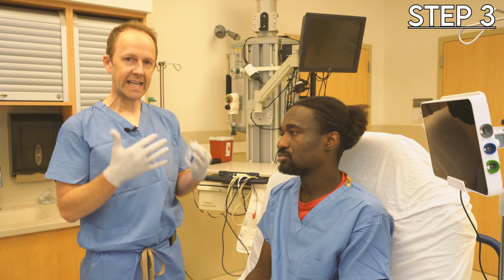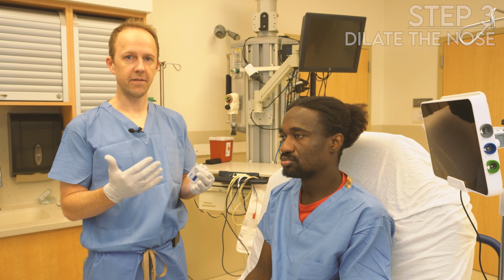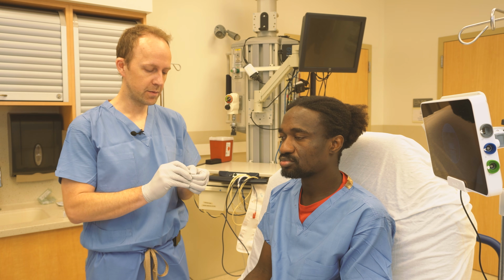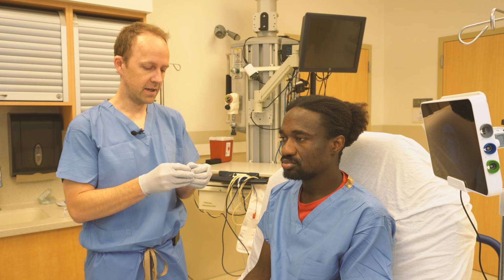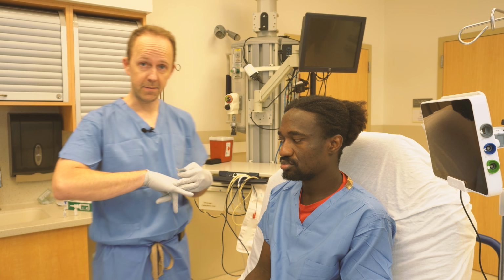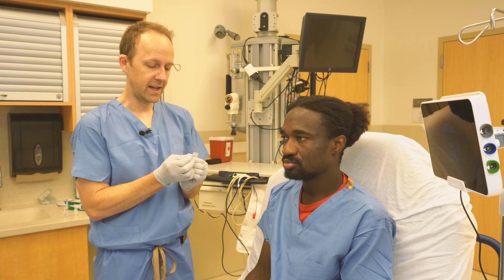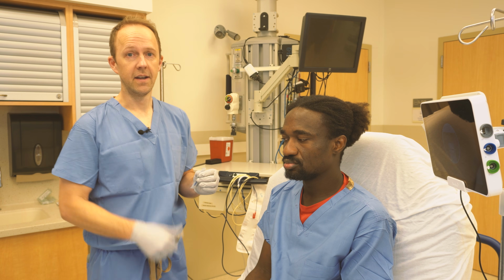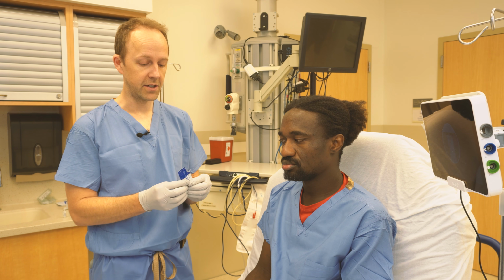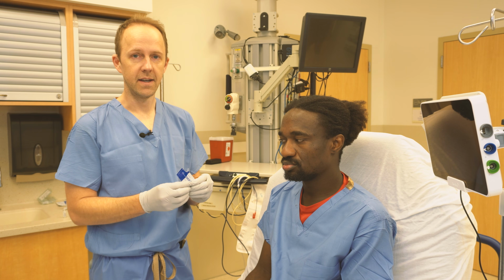So the next step is to dilate the nose to prepare it to be big enough to comfortably accept an endotracheal tube. You need some lubrication, and then you need a pinky finger to dilate. You can really dilate until the pinky finger is all the way to the MCP knuckle, so pretty far in. And again, depending on the patient's preference, either they can do it themselves or you can do it. A lot of patients like to be in control of the procedure because it just gives them that autonomy and it feels better to them.